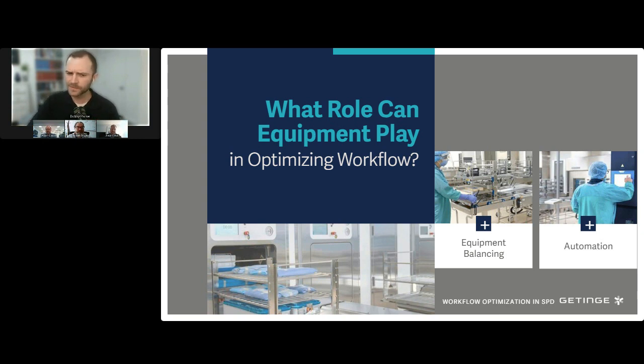important. And from a process perspective, I've seen that play out in technicians' minds as well. And I'm not trying to take over this question, and this has nothing to do with equipment, so I apologize. But the batching at the prep and pack station and moving that onto sterilization, people build this castle of rigid containers around them where you can't even see them over it.